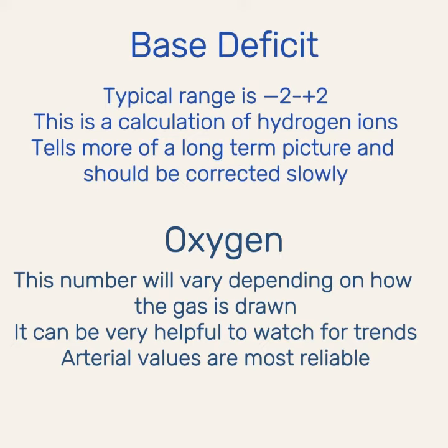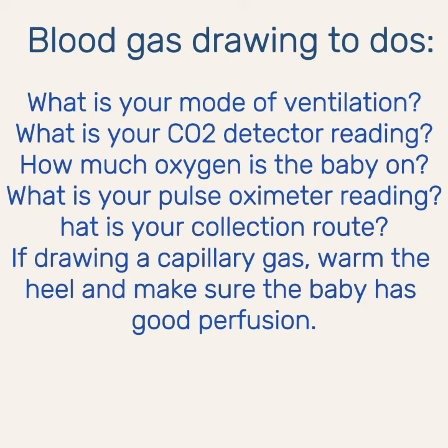Keep in mind when you are drawing these labs what we want to be doing. We want to make sure that we take note of the mode of ventilation, the CO2 levels, the oxygen level, and the baby's saturations. If we're drawing a capillary blood gas, make sure you have warmed the heel and that the baby has adequate perfusion.